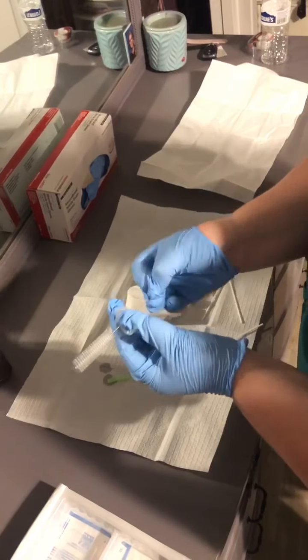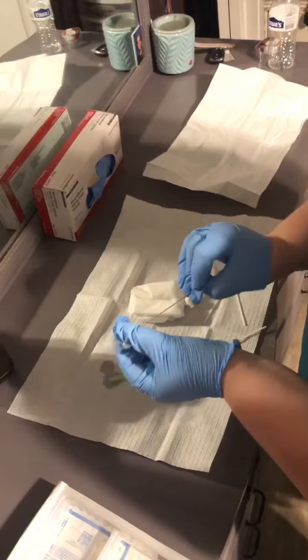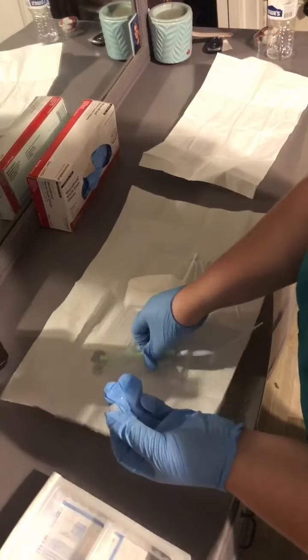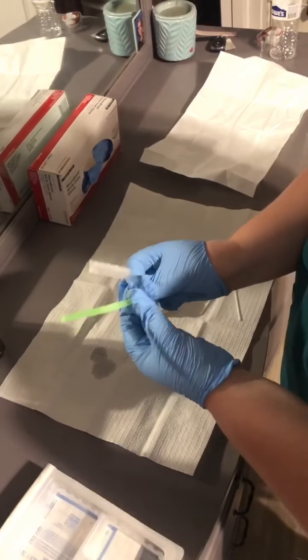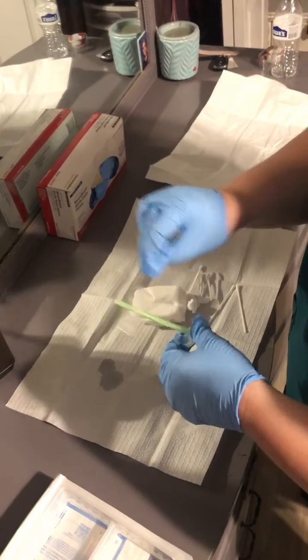So I'll clean the inside of it back and forth, and then once it is in there, I would clean the outside as well, getting off any secretions.